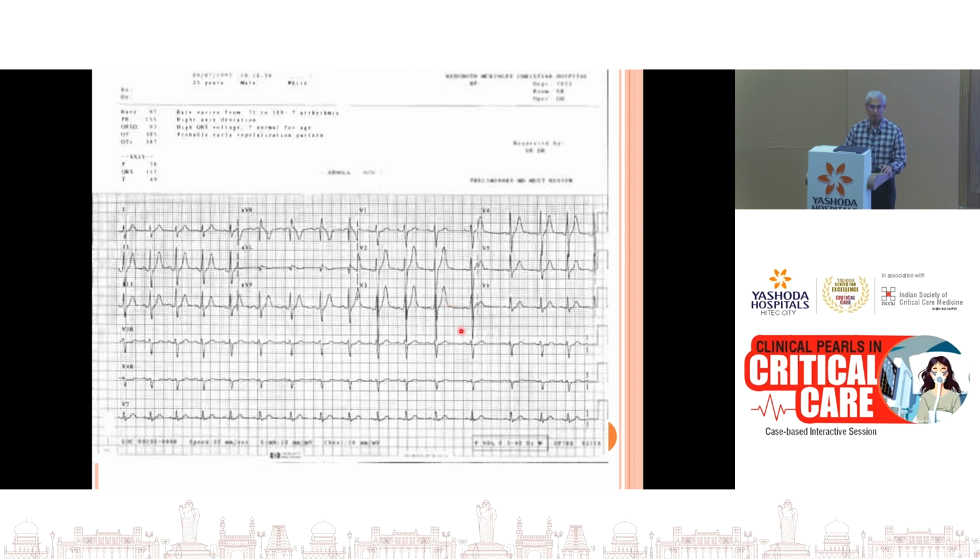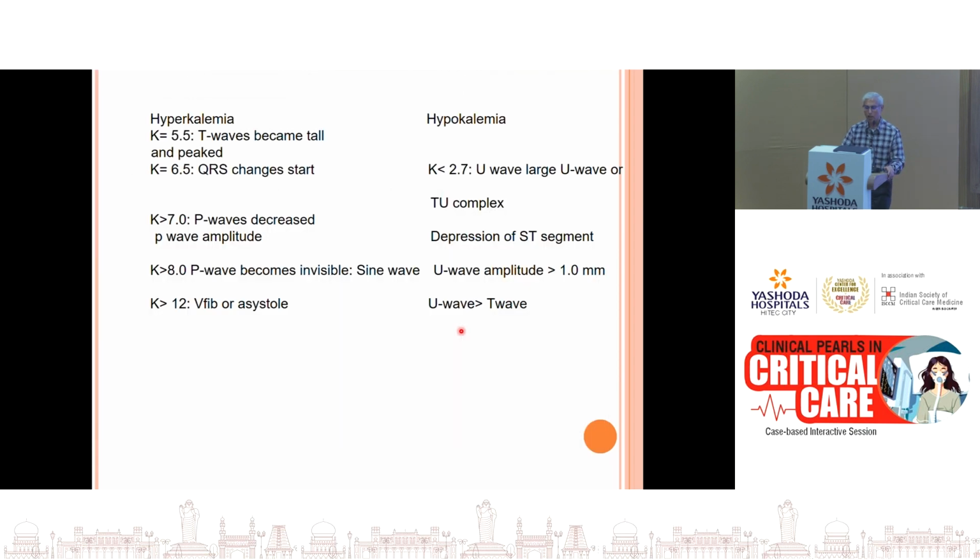So again, this is also very important because the EKG in hyperkalemia is quite sensitive and quite specific, and quite often available before you get the lab, because the lab result takes an hour or 2 hours to come back, but the ECG is there right in front of you. So these are the various stages where changes occur in hyperkalemia and hypokalemia.